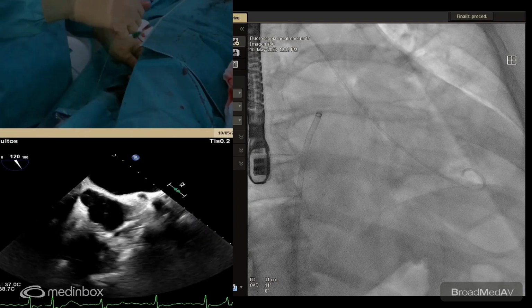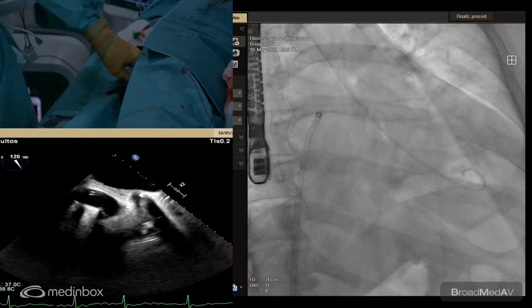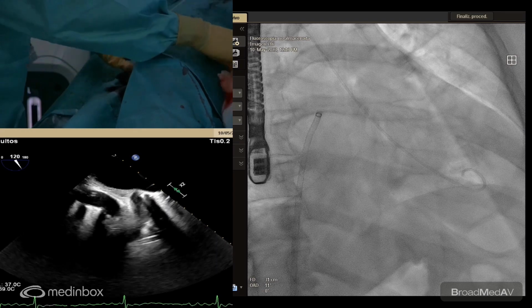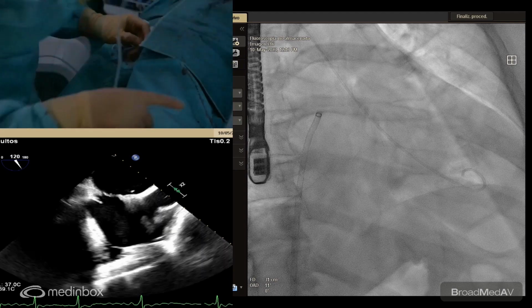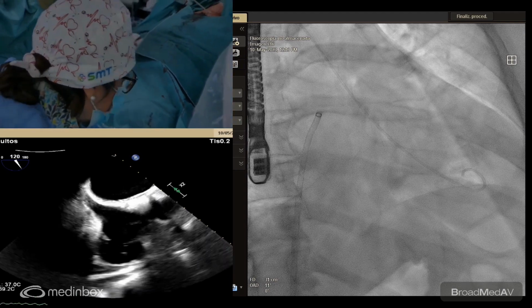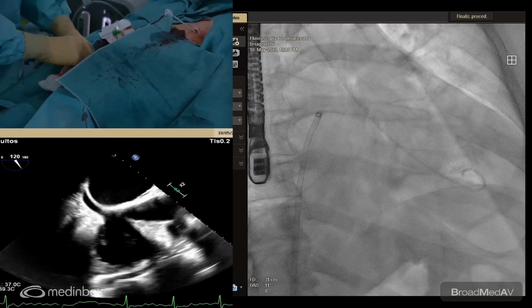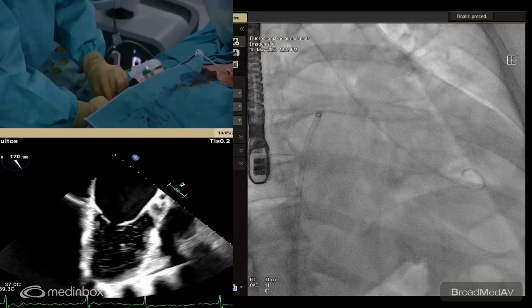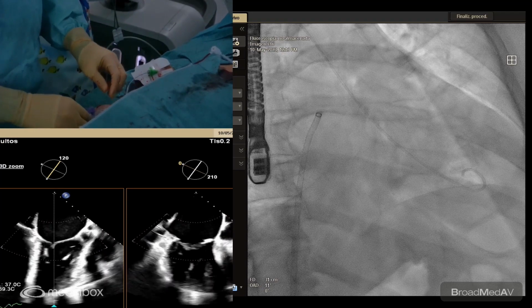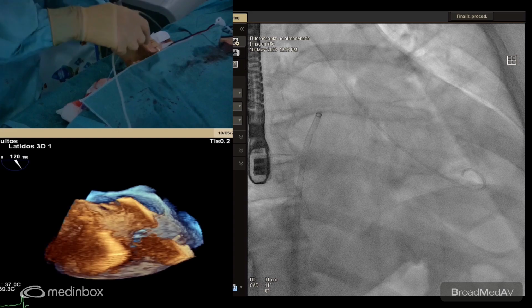There are some questions on the chat. Some questions of the audience? On the chat, yeah. The first one is, is there any commissural calcium, any other negative predictors? It's for you the question, Silvia. If there is, in this case, commissural calcium, yes, there's one calcium nodule in the, one second, I will show again, close to the medial commissure, sorry.